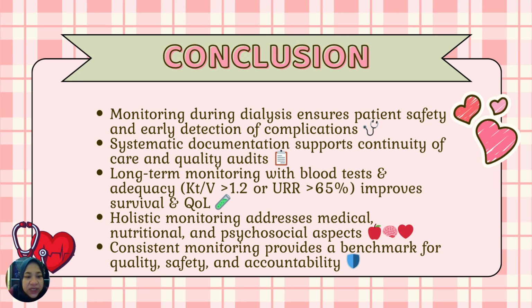So the conclusion is we need monitoring during the dialysis to ensure patient safety and early detection of any complication. Systematic documentation supports continuity of care and quality audits.